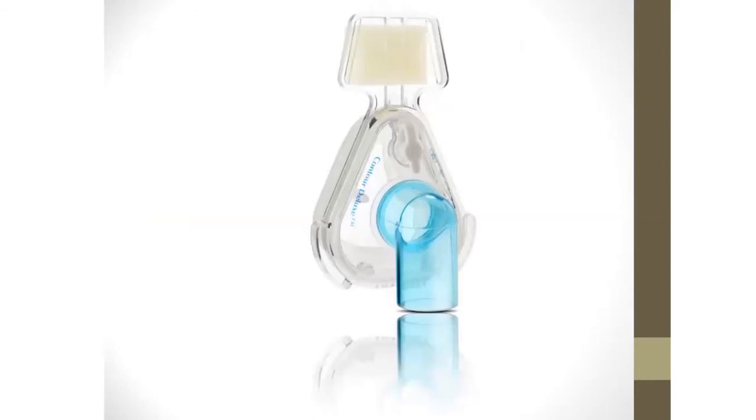These are the different shapes of mask which we use with NIV. First is the nasal mask, which has advantages and disadvantages. Advantages are that it's more comfortable than a face mask, and the patient can talk. But the main disadvantage is that if the patient is a mouth breather, the pressure we want to deliver will not be delivered because of the mouth breathing.